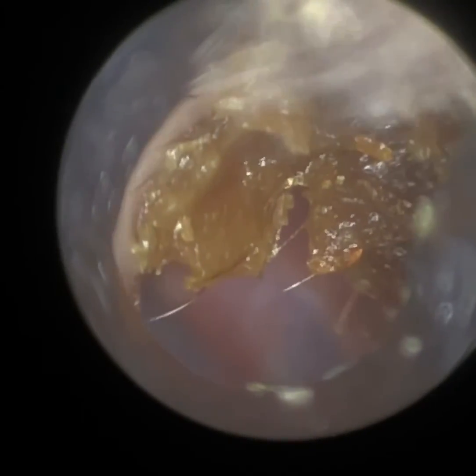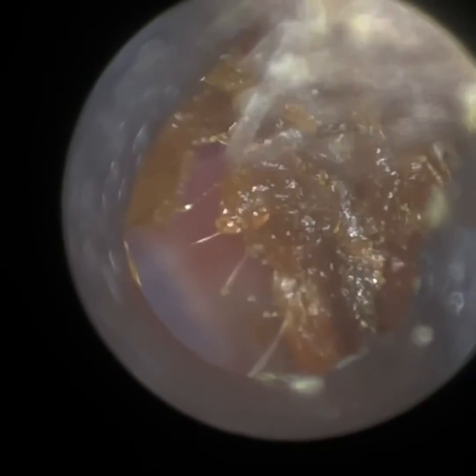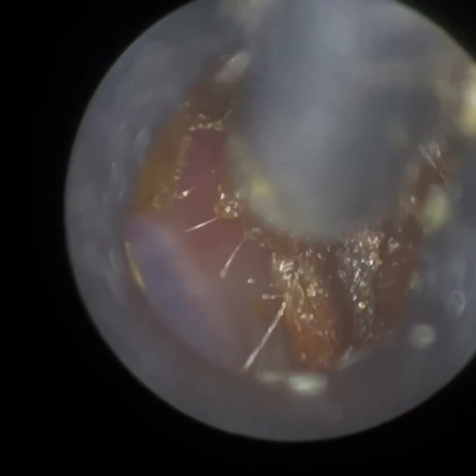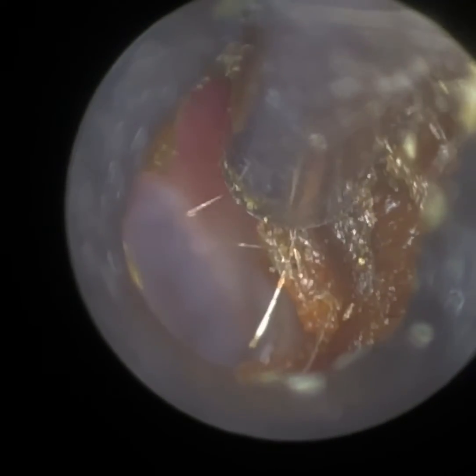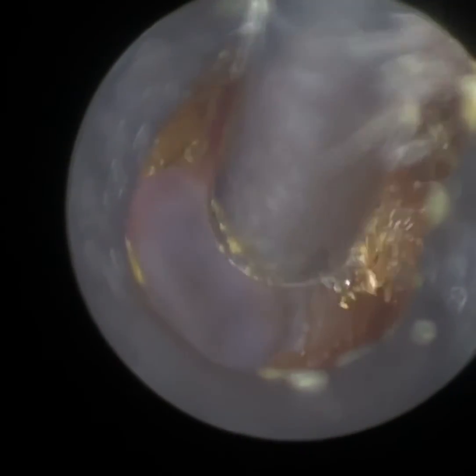It's coming out in a big plug. Even at this stage, the eardrum — there's a clear line of sight. But there's some wax superiorly and posteriorly mid-canal. Let me just go back in and see if I can get a bit more out for the patient, without adding to their anxiety or possibly causing any injury or trauma. I think that's the key with being a clinical ear care specialist. Perhaps everyone's guilty of this — I was, especially at the beginning. You don't realize that less is more sometimes.